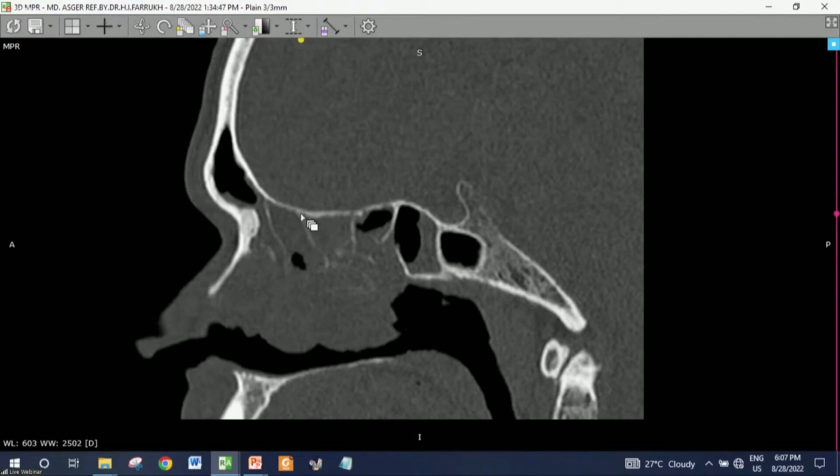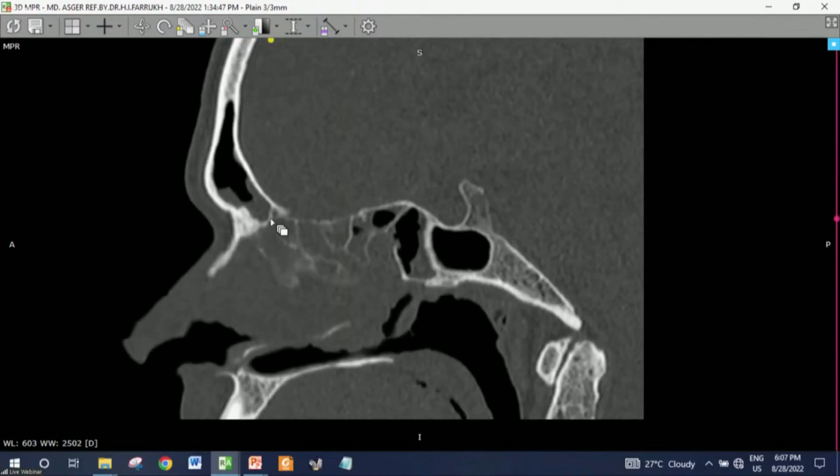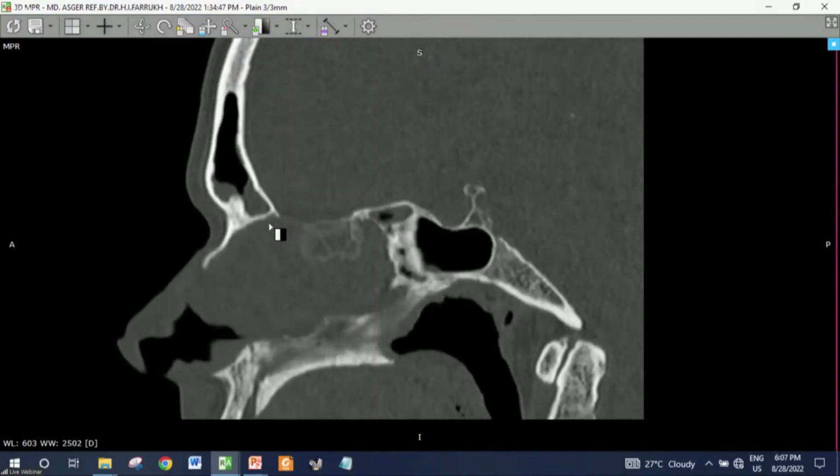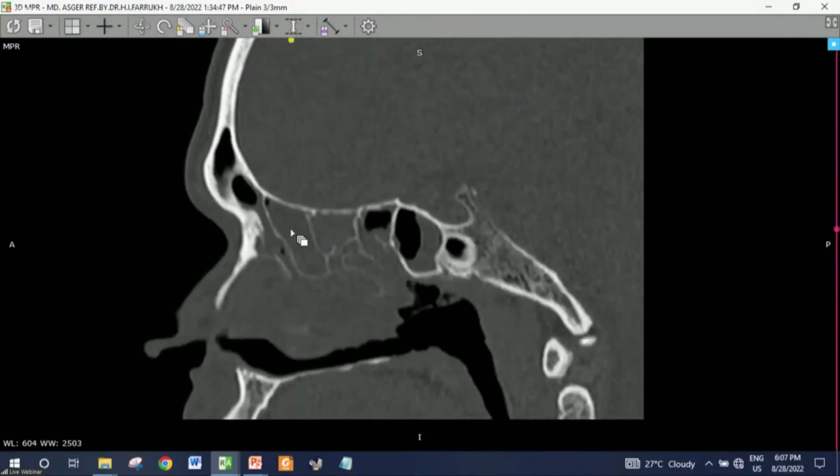Imagine endoscopically: you open your frontal and you have a narrow opening, and behind is the cell, and you have to open up this cell wall now. You have to deal with this differently. You have to open up this cell wall and flush it with the skull base to give a wide drainage. So that's a really interesting anatomy in this particular case.